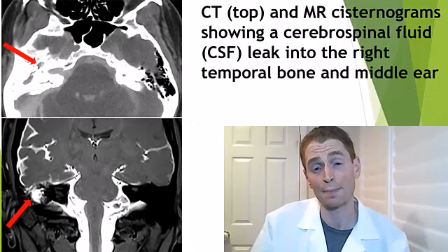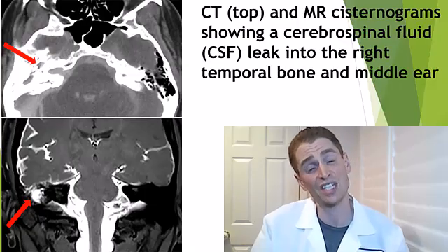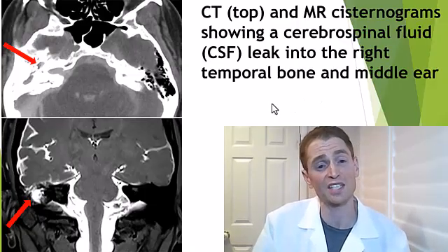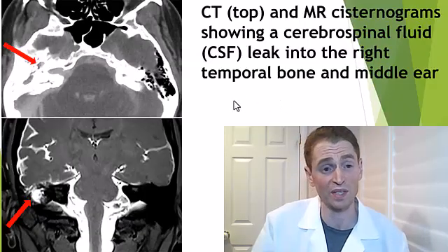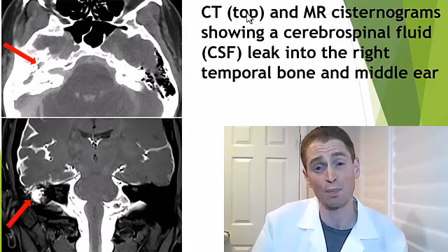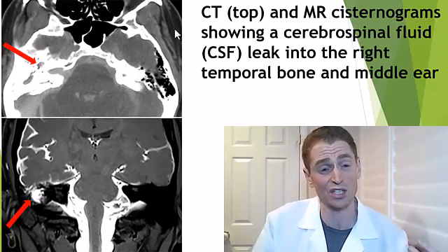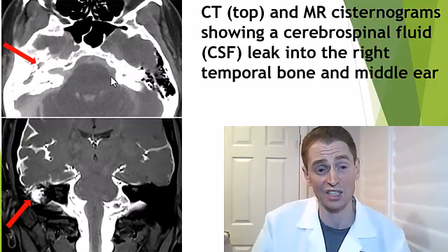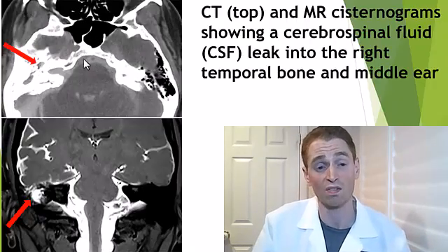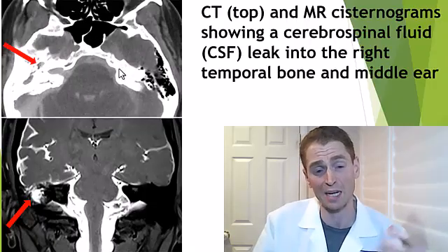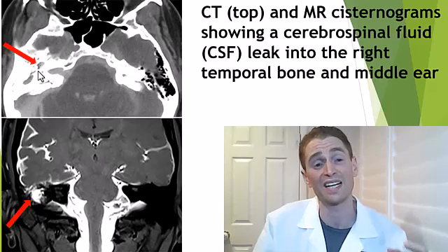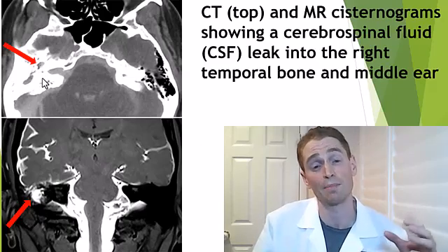Here's an example of a diagnostic test called cisternography, looking at the cerebrospinal fluid. This is someone with a CSF leak into the area of the right temporal bone and the right ear. On top, we're seeing a CT cisternogram where dye is injected directly into the cerebrospinal fluid — not into the arteries or veins — and it fills up the subarachnoid space, then leaks into the area where the leakage is occurring so that it can be surgically repaired.